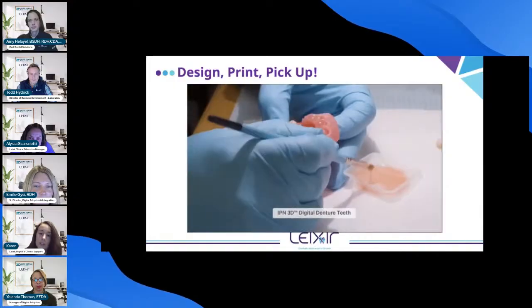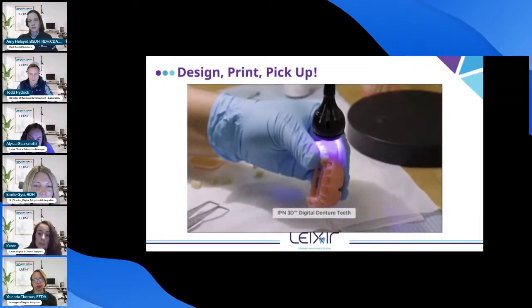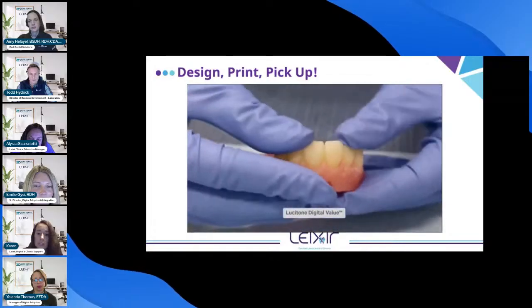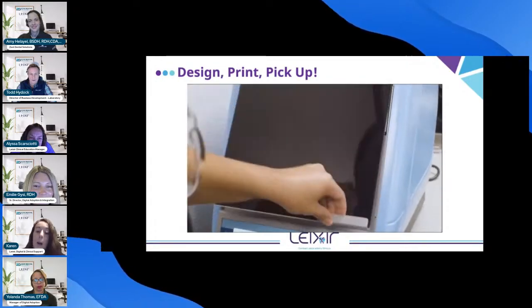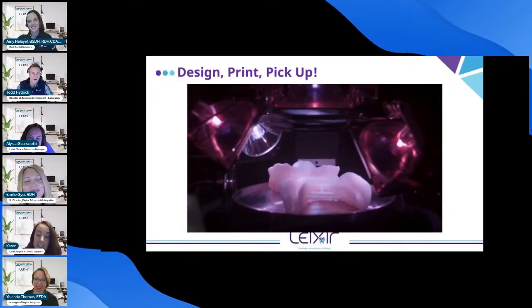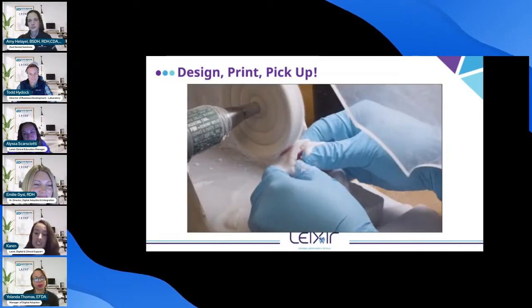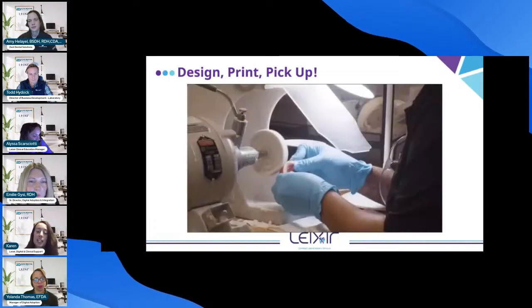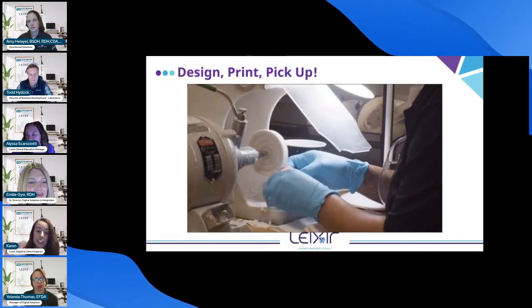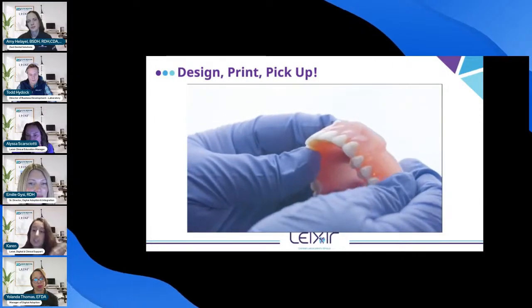So you can see there where there was different, I don't know if you guys saw it. I'm not a huge technical person, so I'm not going to go back because I'll probably end up shutting my whole computer off. But if you saw it quickly, they had the card of the denture teeth, and then they had the design. So that's what I meant by either with this, you're getting, with digital dentures, a custom design rather than picking from a denture teeth card.